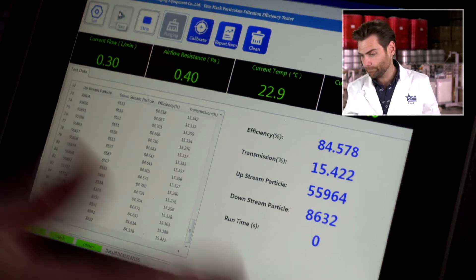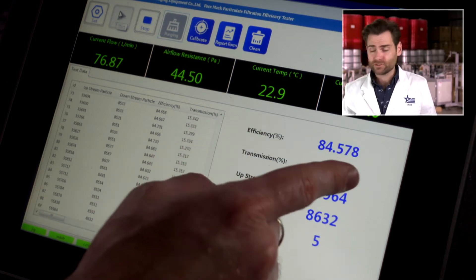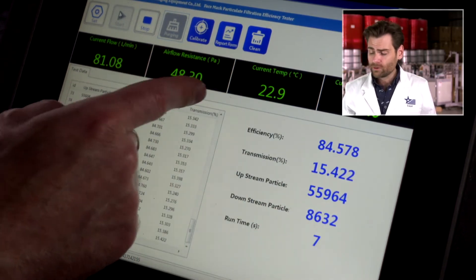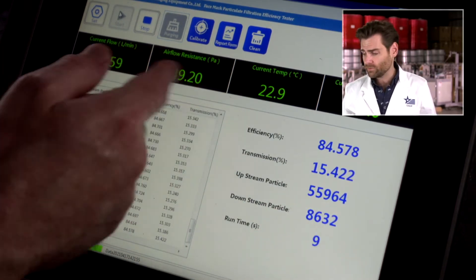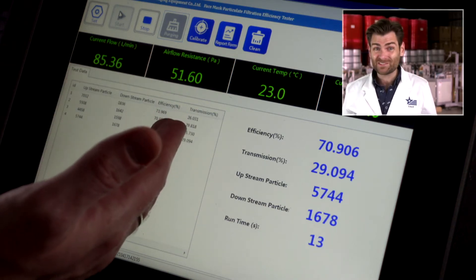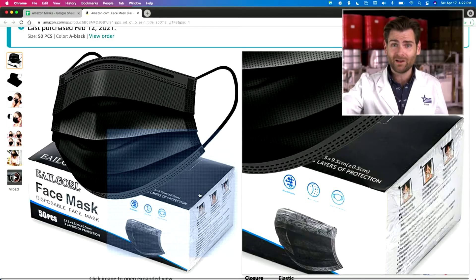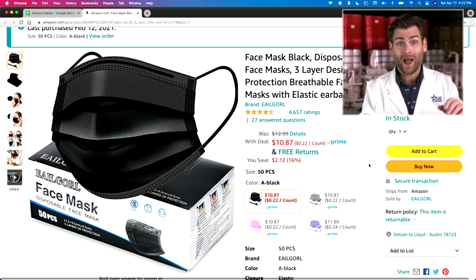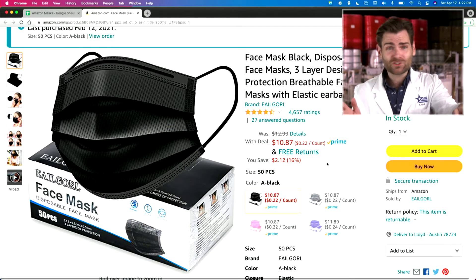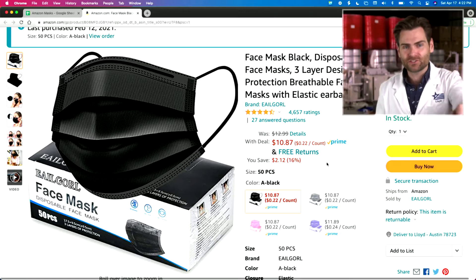Let's let her rip. So this is a particulate filtration efficiency machine. We are mostly caring about this efficiency number here, but also the airflow resistance — how breathable is it? You want this to be under probably 150. This is at 50, so it's super breathable. I switched off the screen because I don't want to tell you what it's going to be — otherwise you'd just fast forward to the end. Wait, you could do that anyway. YouTube features.